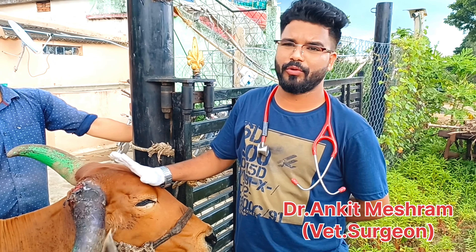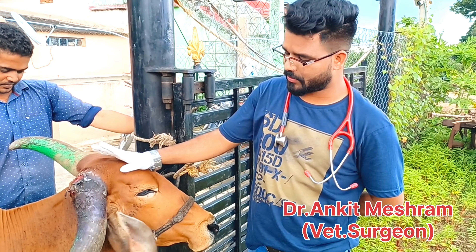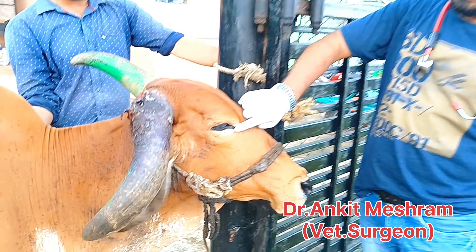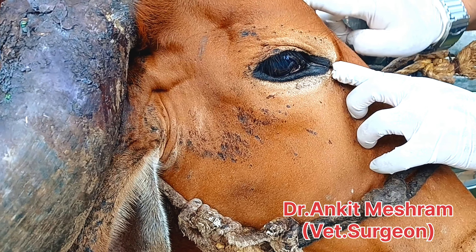But in the case of goat, you have to do an infratrochlear nerve block. The infratrochlear nerve block is made from the medial canthus of the eye. From the medial canthus of the eye, you have to go to the base of the horn.